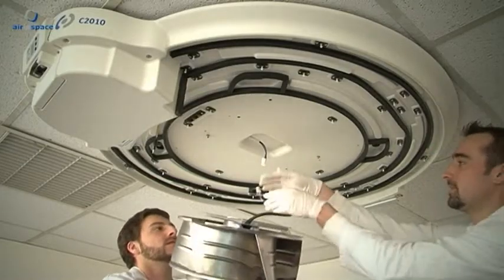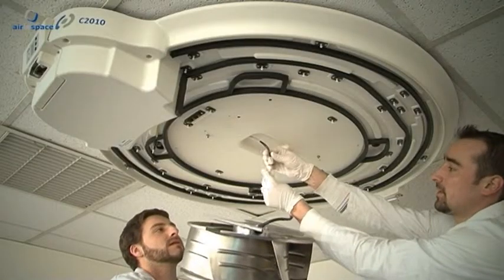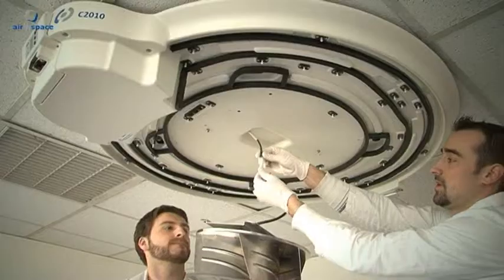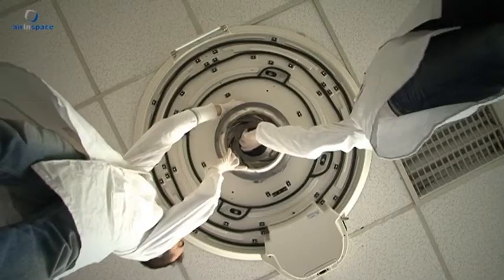Installing the ventilator: Pick the ventilator up with one hand, holding it by the centrally positioned motor. Connect the connector to the base. Position the ventilator on the two bolts in the base, add the other two nuts, then tighten all four bolts.